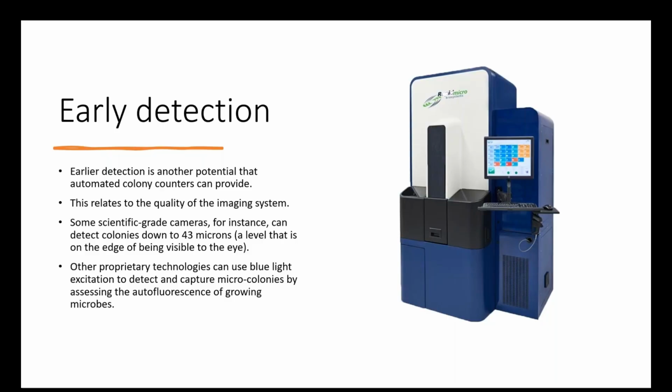A number of these technologies can use factors like blue light excitation to detect and indicate the presence of these micro colonies.